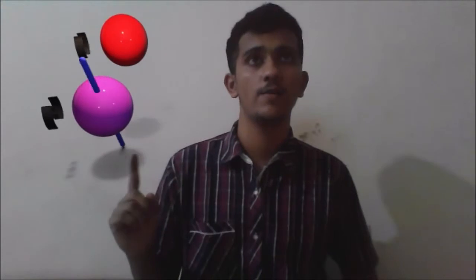To see how it works, we go to the simplest available atom, the hydrogen atom. This is a hydrogen atom. And since the proton, which is a charged particle, also keeps spinning, it generates a magnetic field, also known as the magnetic moment. When placed in an external magnetic field, these atoms align their magnetic moment along with that of the external magnetic field in a parallel or anti-parallel fashion. The rate at which these protons spin around themselves is directly proportional to the strength of the external magnetic field.